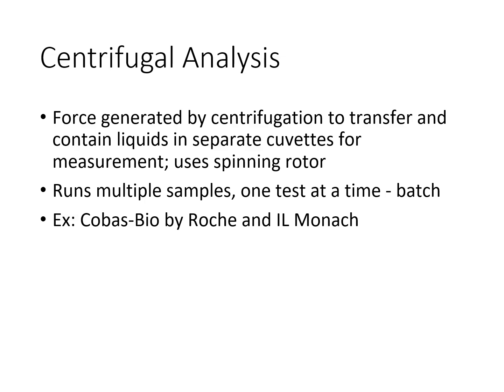So some historical stuff on this. The centrifugal analyzers represented an important intermediate step in the evolution of lab automation. It helped to bridge the continuous flow methods to the discrete analyzers.